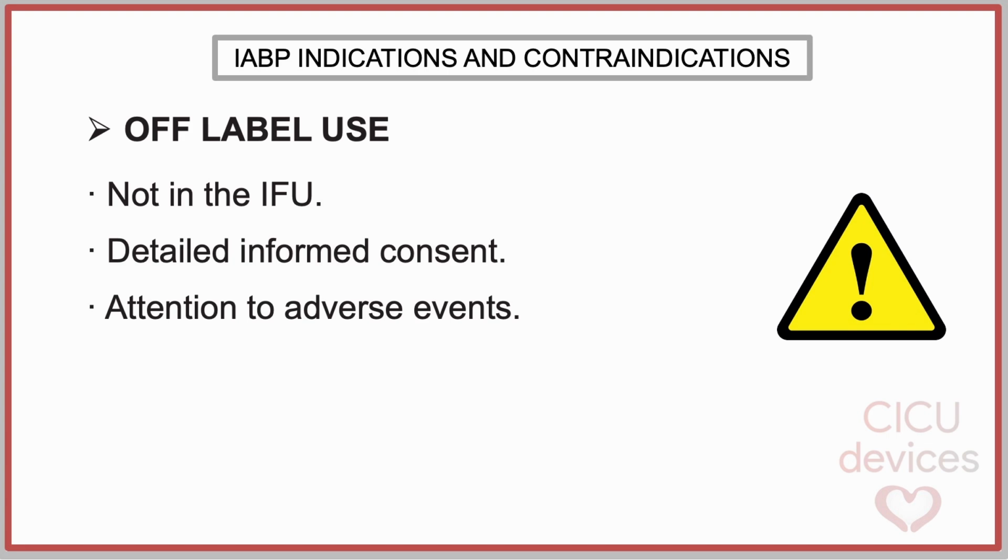There are several off-label uses of the intra-aortic balloon pump that are not included among the approved indications established by the relevant regulatory agencies. In these situations, a detailed informed consent must be obtained from the patient, and special attention should be paid to the potential occurrence of adverse events.